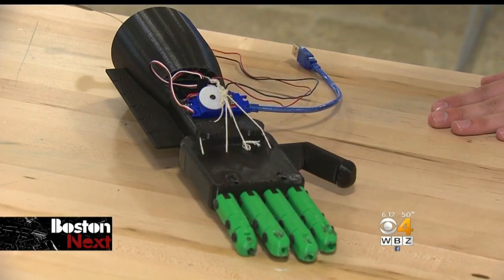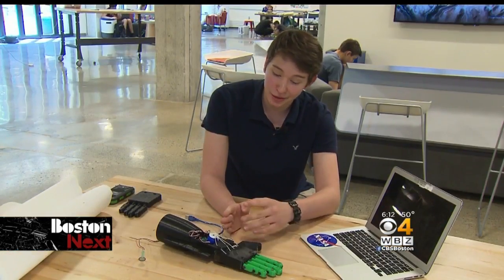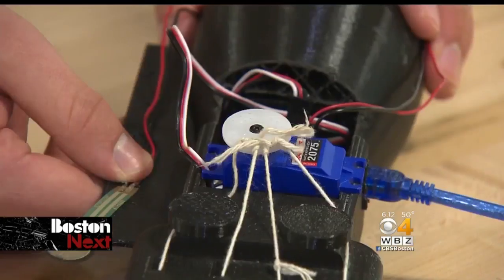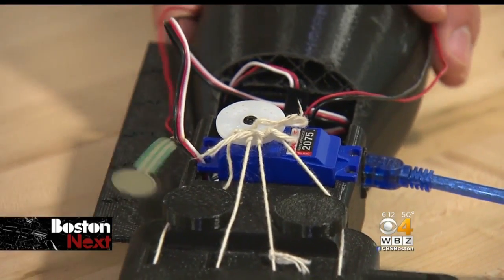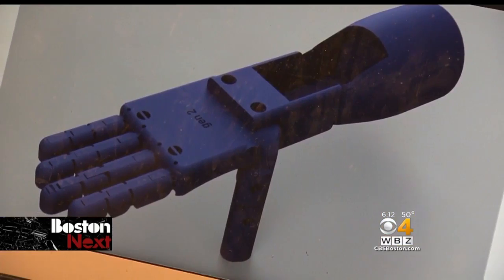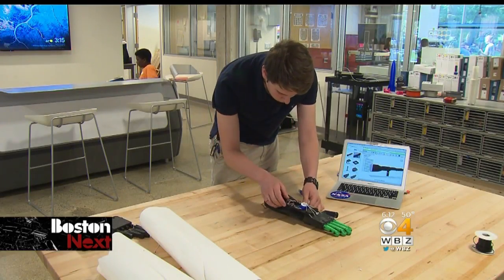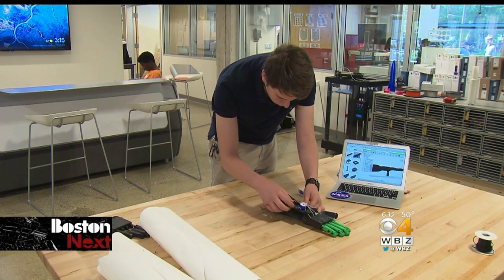Christian has equipped it with a ruler and a thumb drive in the thumb. I want it to be almost customizable in the sense that they can pick and choose what they want on it, but it's still able to help them replace the limb they don't have. Christian is still working on the design, and he wants it to eventually look more refined. He plans to release the files for it online, so people who can help with 3D printers or people who need prosthetic limbs can use those files for free to create their own.